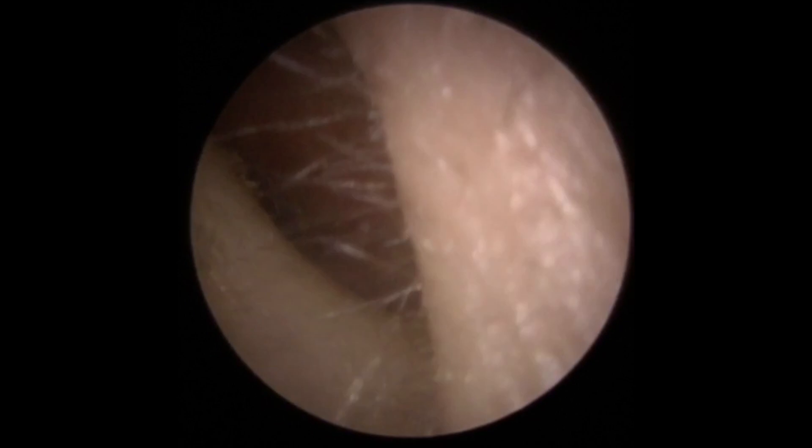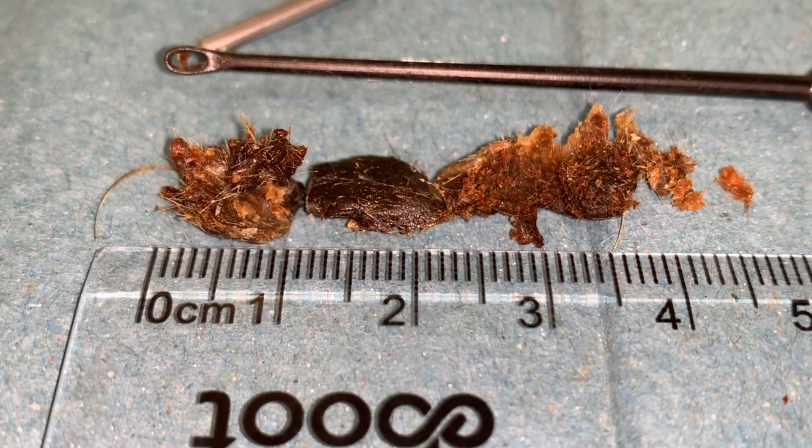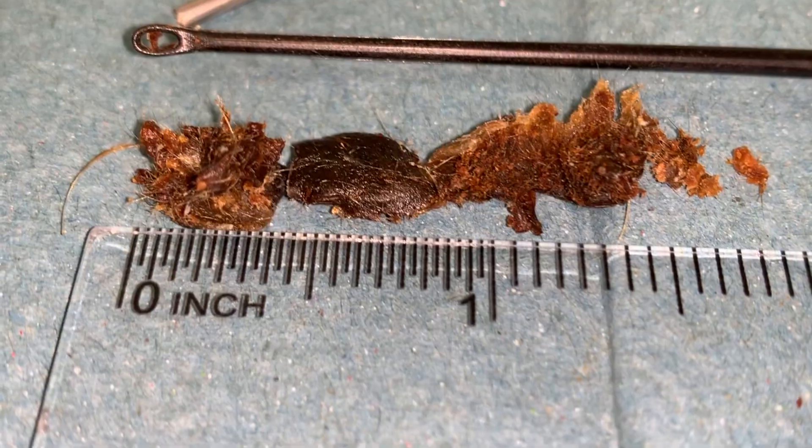You can see the whole thing is getting more movement now, rocking back and forth. It just broke a chunk off the front, so we go back in again, aiming a little bit higher. You can see it starting to roll — the back end of the wax is now rolling forwards, loosening everything up from the canal walls. As we pull, the whole thing comes away. There's the eardrum. The left-hand piece up to a centimetre is what we took out of the first ear, and the remainder is what we took out of the second ear.